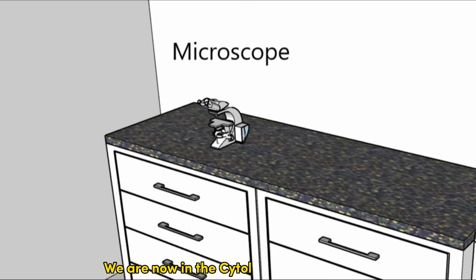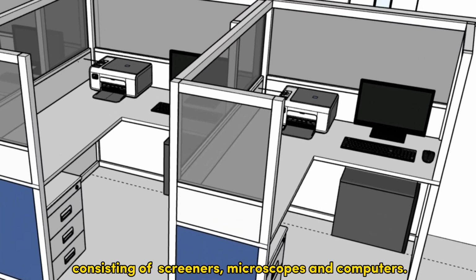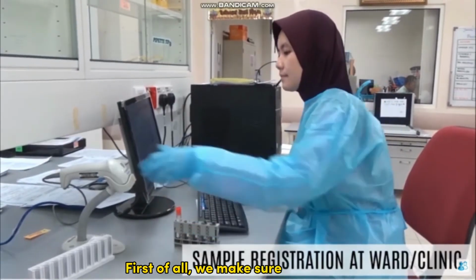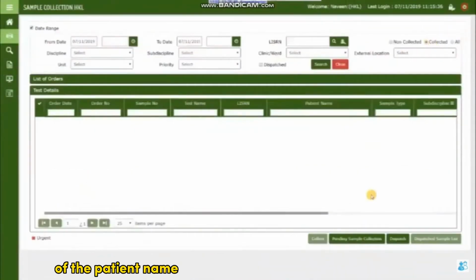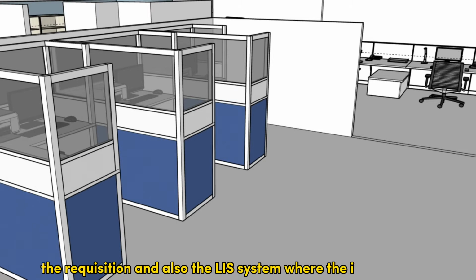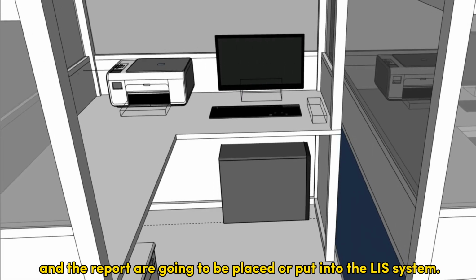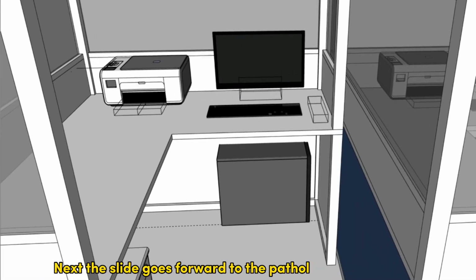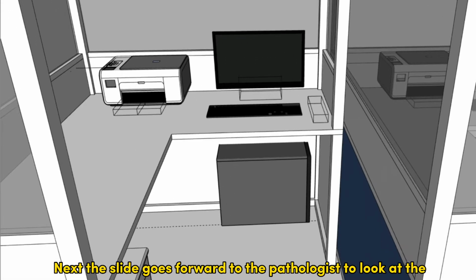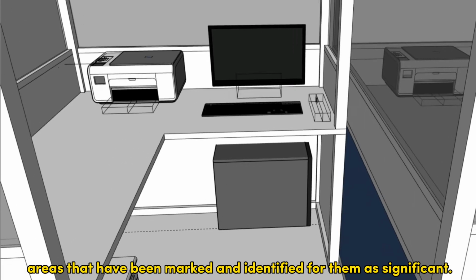We are now in the cytology screening room, consisting of screeners, microscopes, and computers. First of all, we make sure the patient name on the sample matches the patient name on the slide, the requisition, and also the LIS system where the interpretation and the report are going to be put. Next, the slide goes forward to the pathologist to look at the areas that have been marked and identified for them as significant.